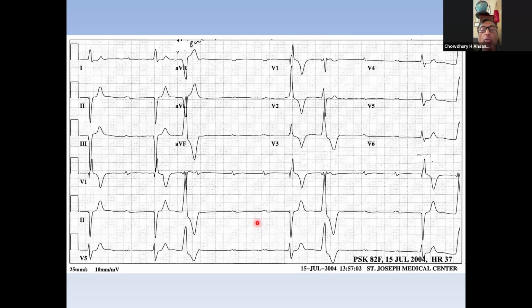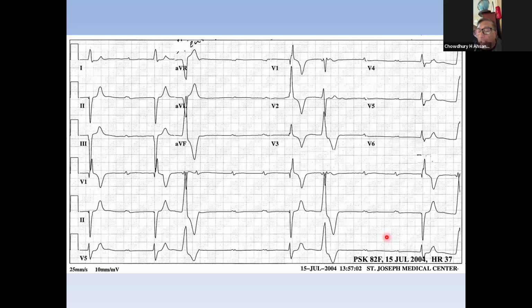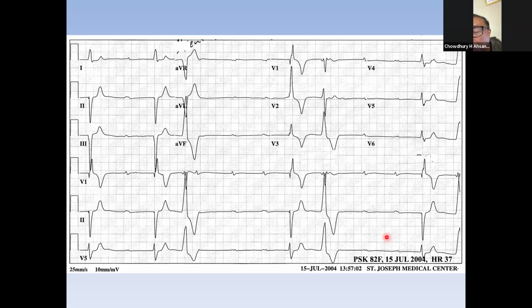So Rafique bhai, a question. If it is atrial fibrillation with slow ventricular rate, and the RR interval is irregular, and the P wave is replaced by fibrillatory waves, or we don't see the P waves at all, the question is, will we call it slow ventricular rate with a ventricular mechanism, or how to differentiate? Because if the patient is good and the ventricular rate is slow, we just stop the drug and wait and watch.